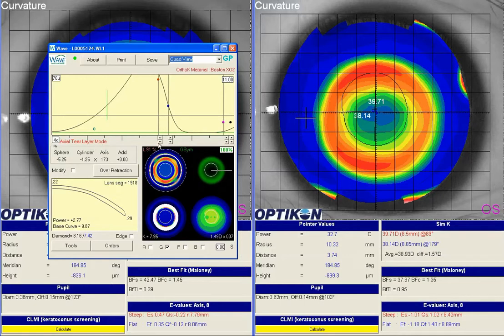And that's too much. And I'm just going to double check the meridians. So it looks like we're centered right around 235, which I think should work. So this lens is getting pretty flat. Perhaps one other thing we can try is to reduce the sagittal depth of the lens a little bit.